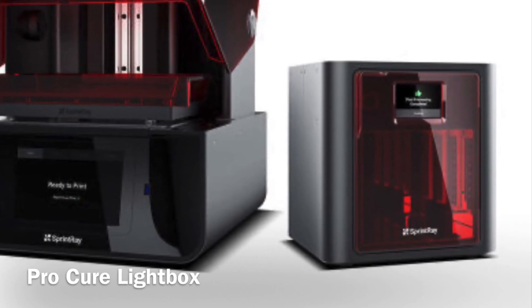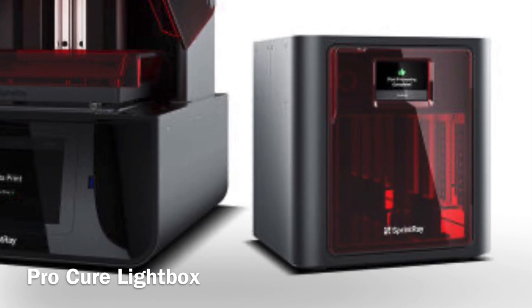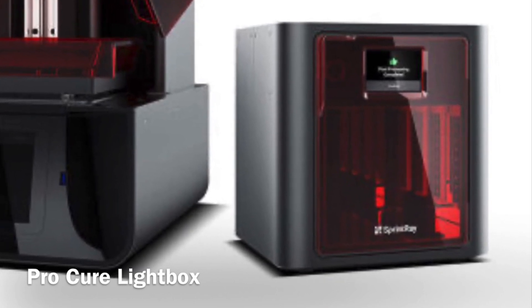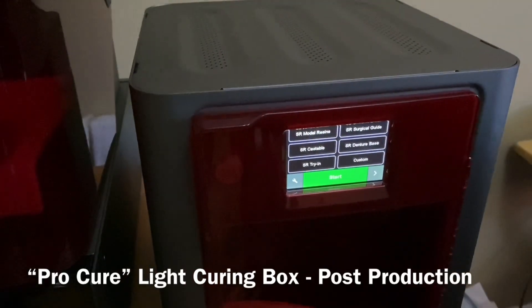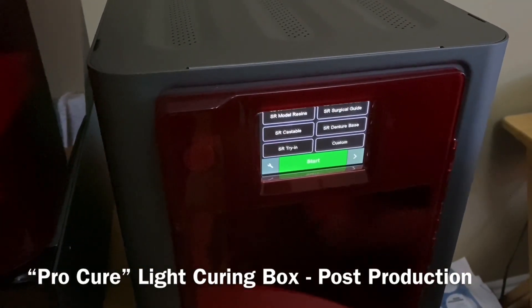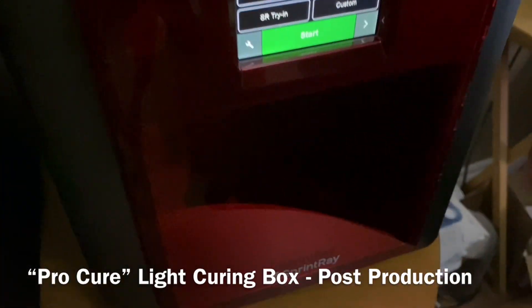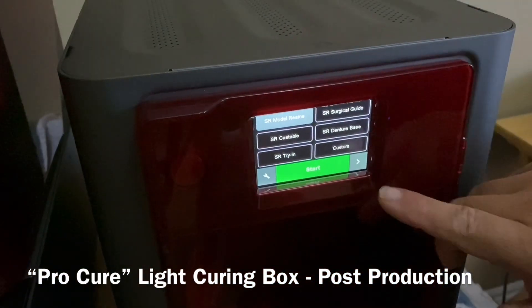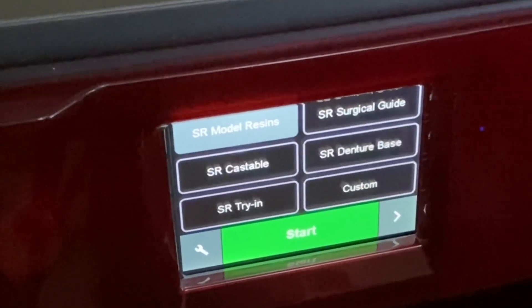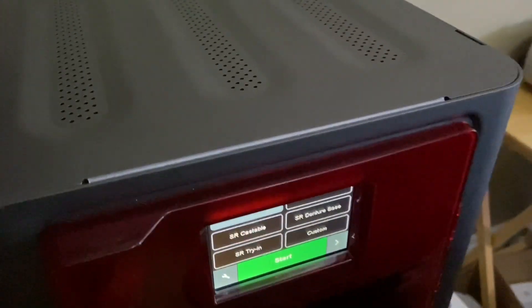Once the project has been printed in 3D form, you're going to do a post-cure with the ProCure light box. After you print your models, you just wash them in an isopropyl wash bath, then bring them over here, select your resin type - let's say model resin - and push start and it'll just cure away. It will cure in a really fast time too.